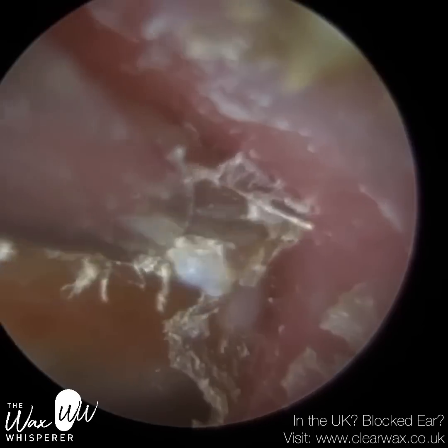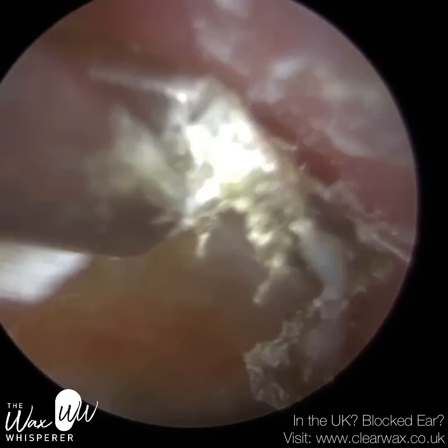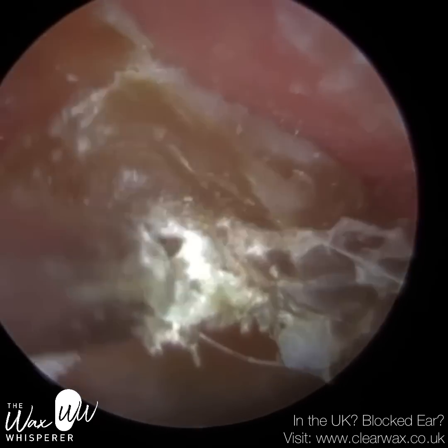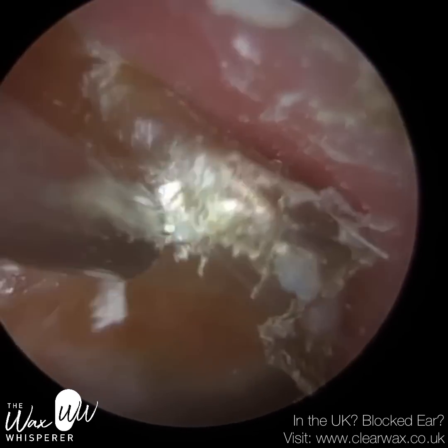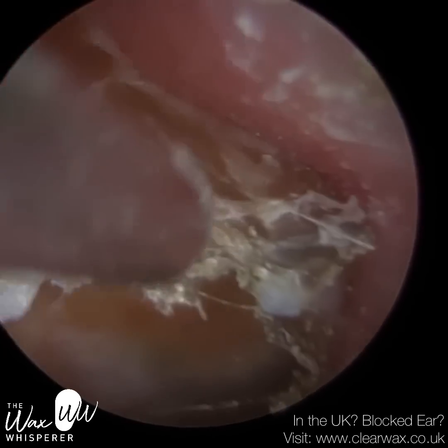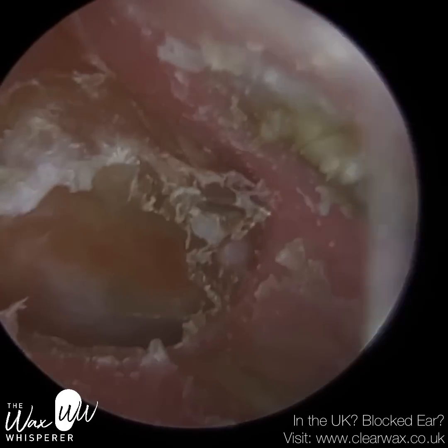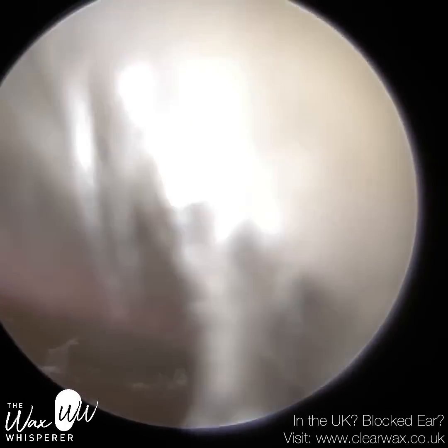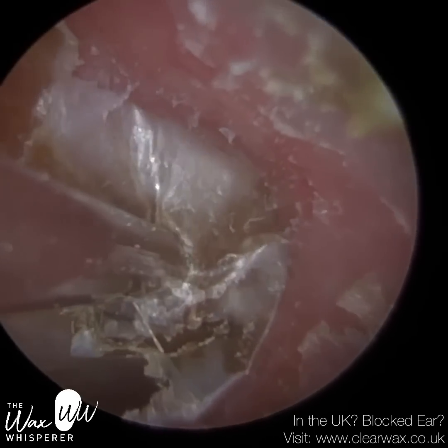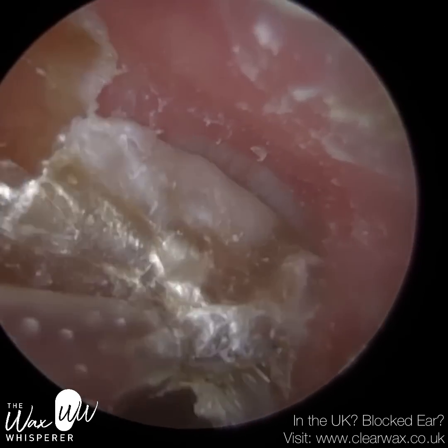We're slowly peeling the skin away, and to the naked eye the eardrum looks fine — you would have thought it looks healthy enough, a bit dull, but fully visible. But there's this layer of skin attached to the eardrum, and as I start peeling it away, the eardrum itself will come into view and you'll see the contrast. The eardrum has three membranes. The outermost membrane is made up of the same skin that lines the inner two-thirds of the ear canal — a very thin epithelial layer of skin, less than 0.1 millimetres in thickness.